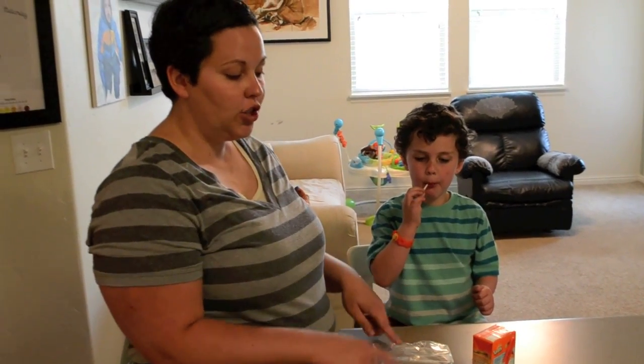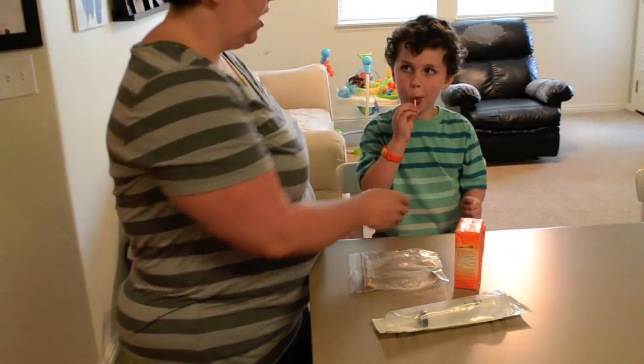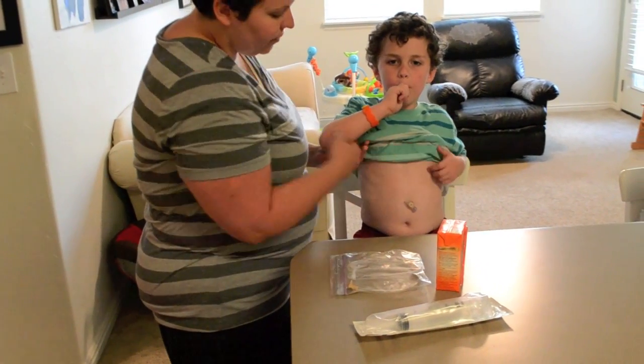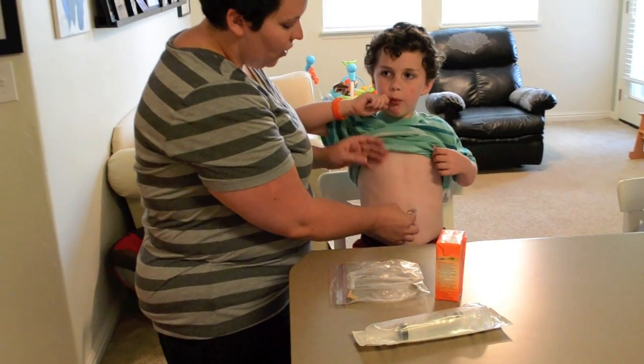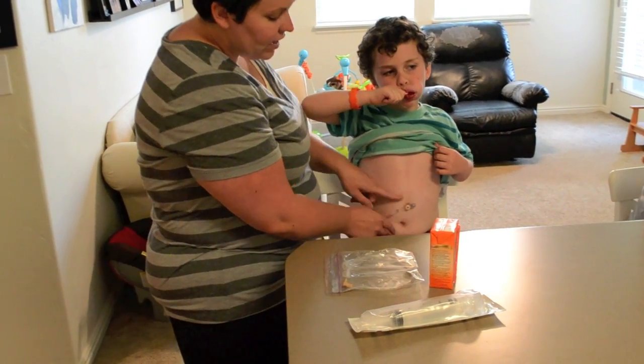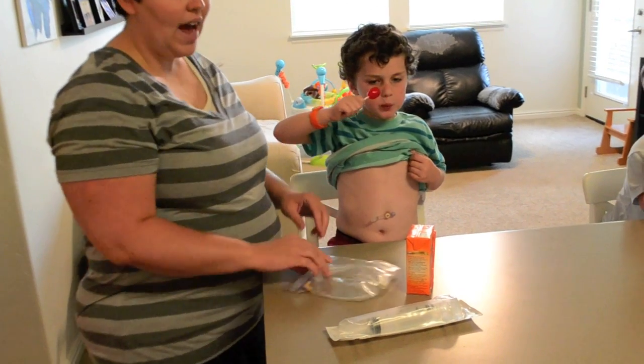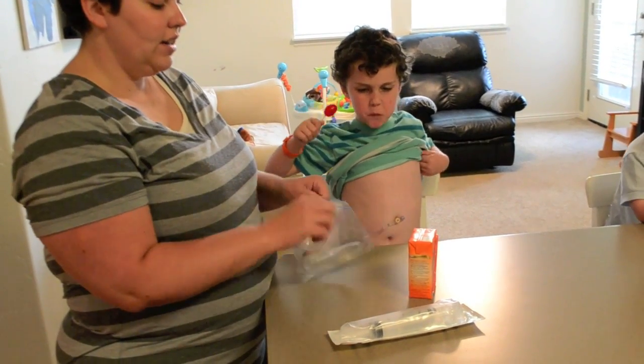Every day Kyle will come to school with a tube, his box of formula, and a syringe. He'll sit down for you. It doesn't matter if he's eating while you do this — this is just to keep him quiet. His button will be here. You can open it; it might already be opened. If it has a dressing, just ask him to remove it and he can take that right off for you, and you'll be ready to go.